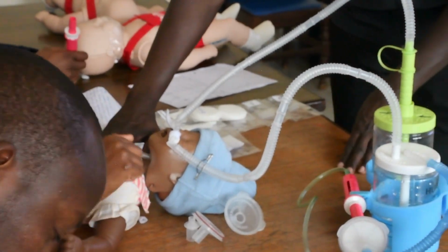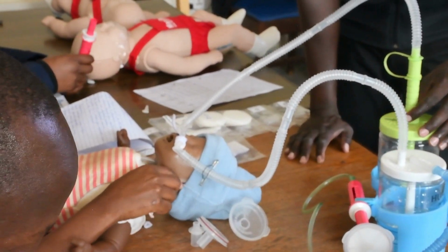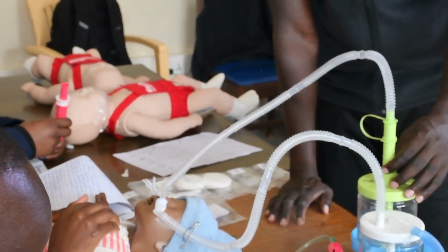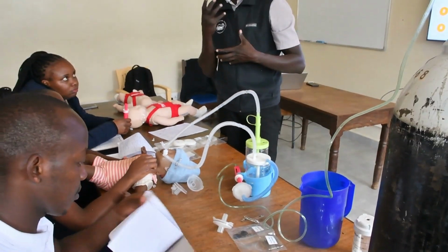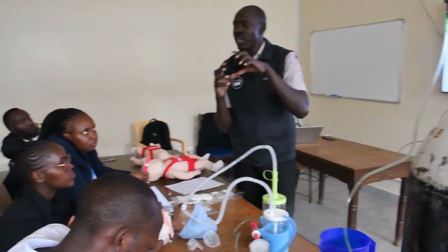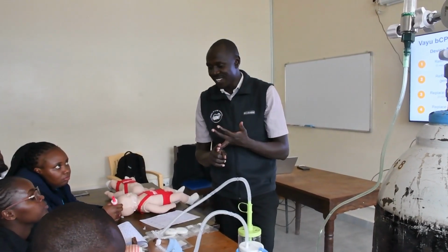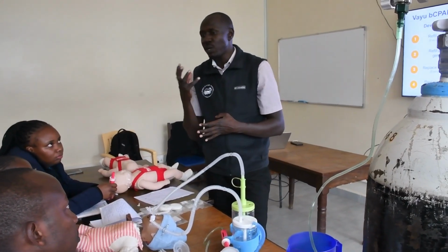Okay. If the work of breathing is high, you come back to the device and check if you really have the appropriate settings for the device. If your pressures are good. If you are at 6, you may consider going to 7. Because what we need here is the pressure to open the alveoli, open the collapsed airways, recruit more alveoli, and keep the alveoli open. That's the whole point. When the alveoli are open, when more alveoli are recruited, when the airway is patent, this is when you can meet the inspiratory demands of the baby.